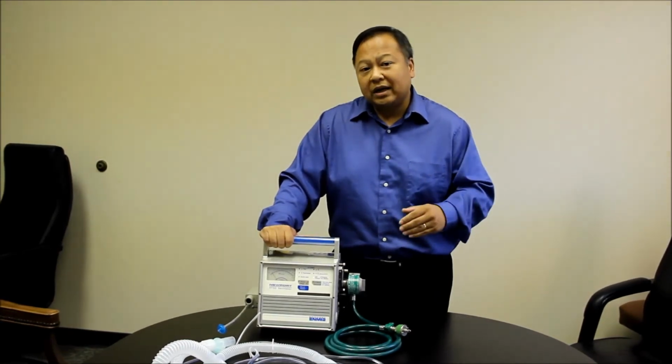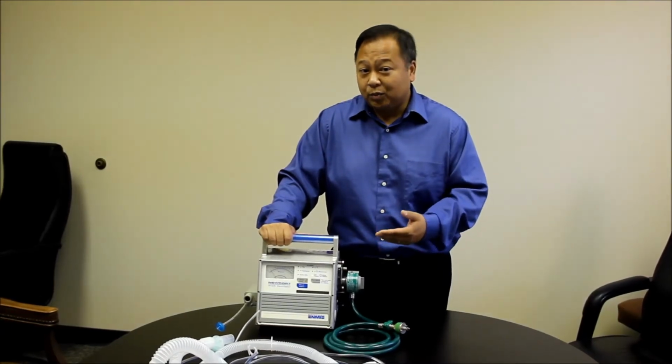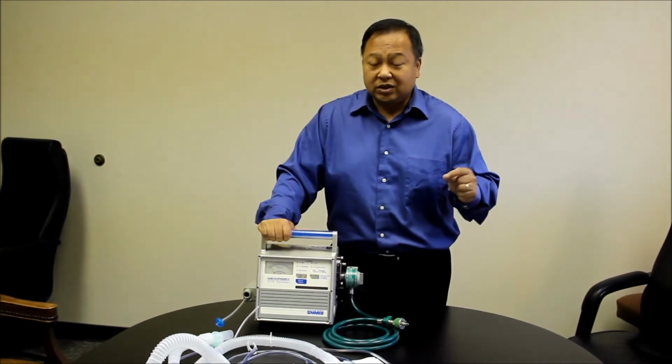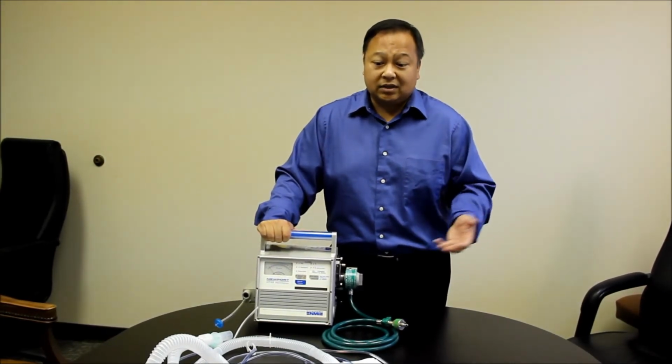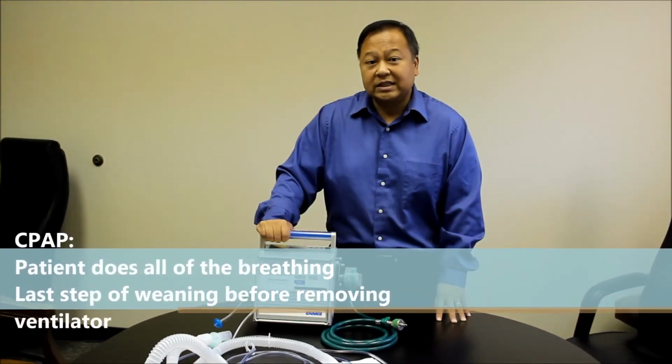own. Going back, the assist control mode, pretty much whatever is being delivered, whatever volume you're putting into the ventilator is the volume that the patients are getting. So even if the patient triggers the ventilator, they'll get the entire 400 mLs that we put in. And the last mode that I'd like to talk about is called CPAP.